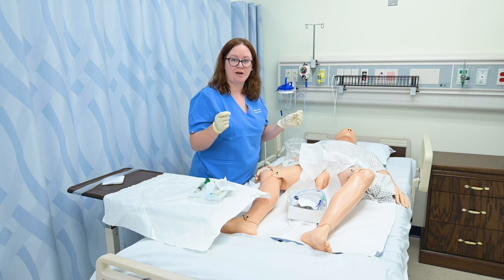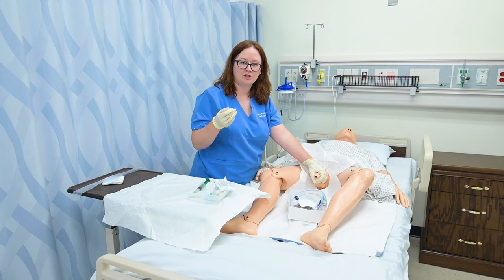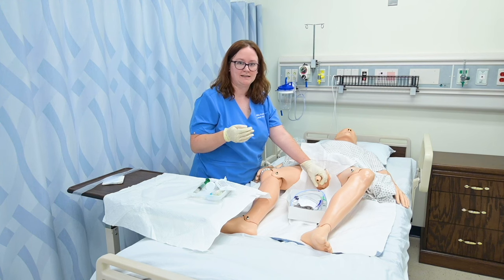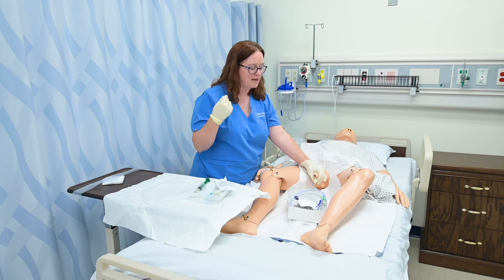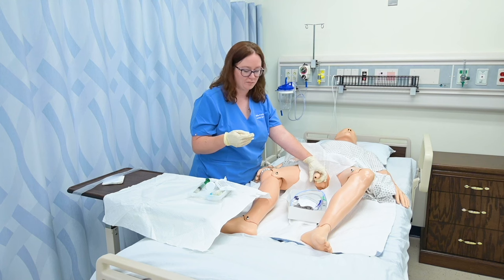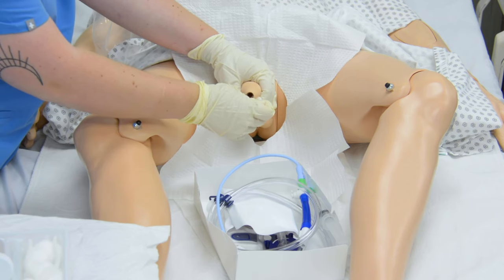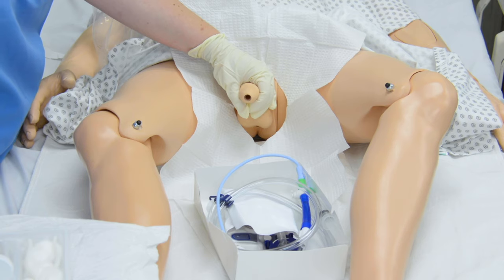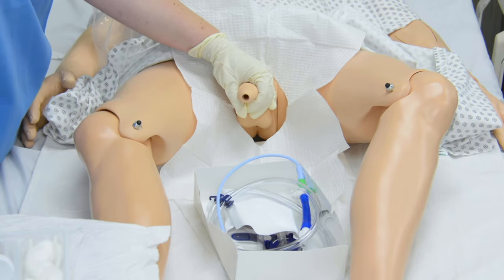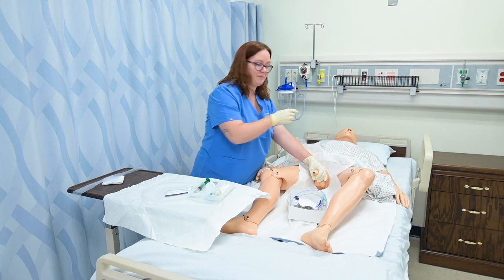Once I've set up my tray, I'm going to go ahead and prepare the penis. I'm going to take the penis and ideally hold it at about a 90-degree angle. If he were uncircumcised I would need to pull down on the foreskin to expose the meatus. I'm going to hold the penis and do an outward loop with my first swab, my second swab, and my third swab, discarding these swabs in the bag I've already set up.